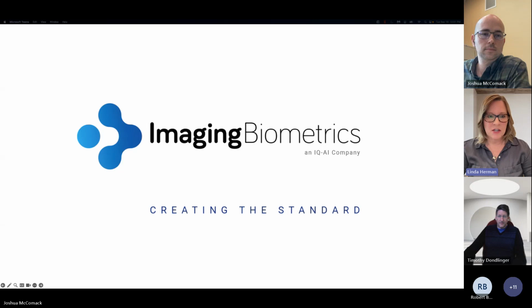Today's webinar, titled Integrating IB Clinic and Routine Clinical Workflows, focuses on the use and clinical application of IB software. It's being presented by Josh McCormack, Senior Software Engineer for Imaging Biometrics.